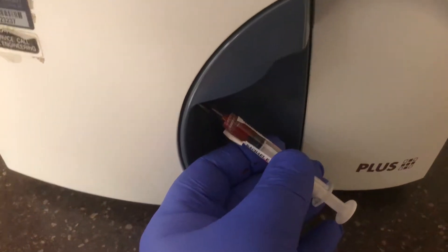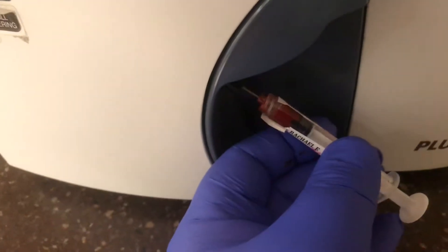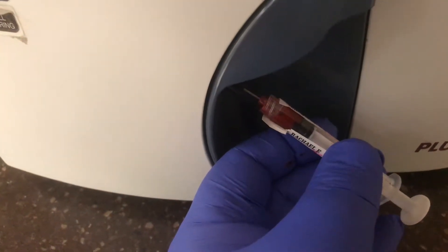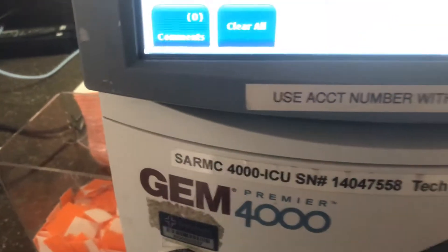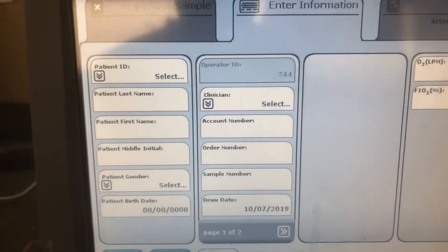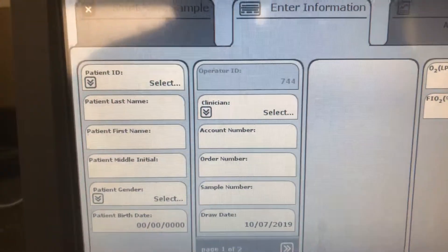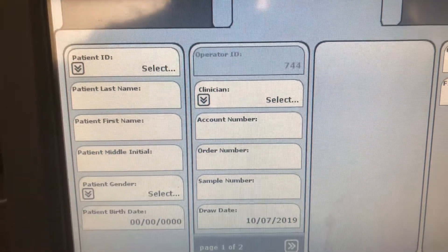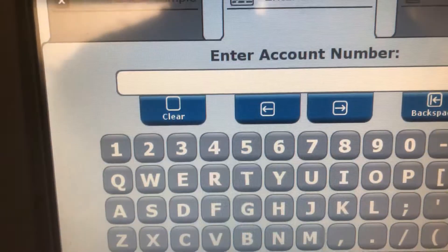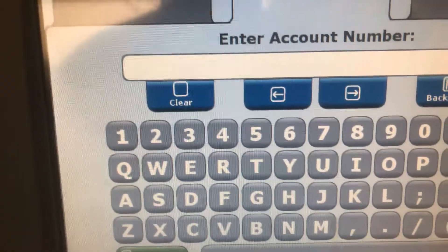You're going to press okay and it's going to start aspirating. You'll get some beeps here. Pull it off and discard your sample. Now you're going to select the account number — this is where you scan your patient label.